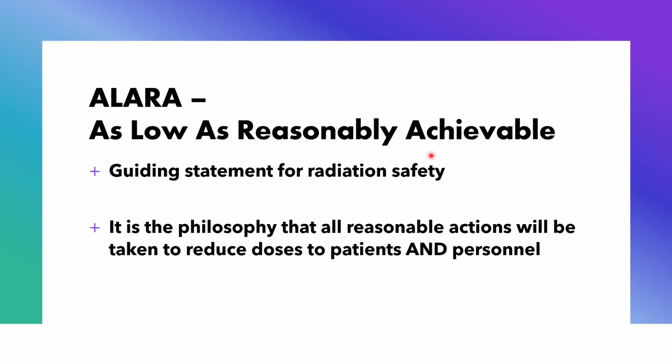I can't tell you exactly how much radiation you need to use on any given situation or patient, but we always want to use as low radiation as achievable to get a quality image. So it is the philosophy that all reasonable actions will be taken to reduce dose to patient and personnel.